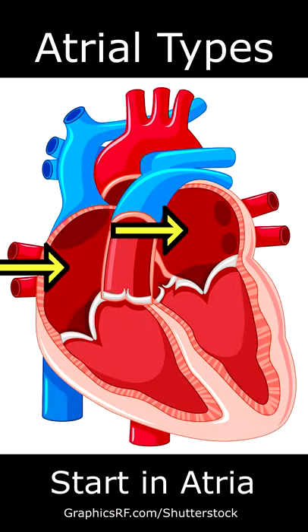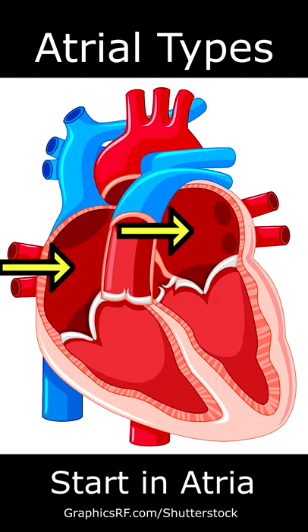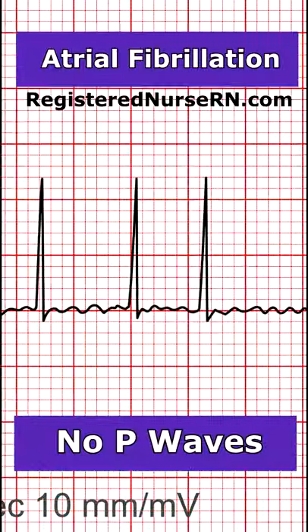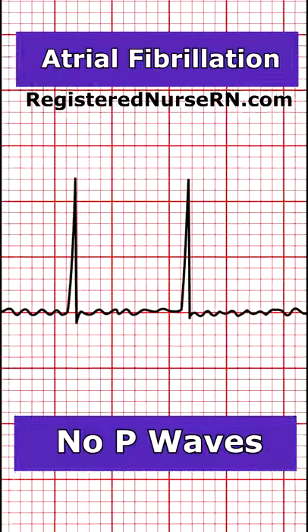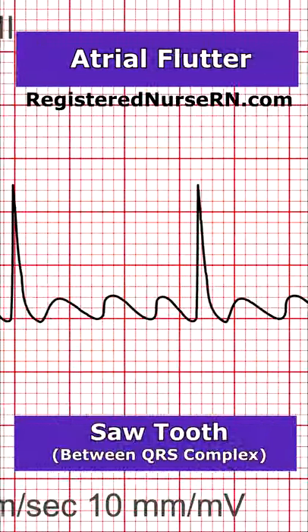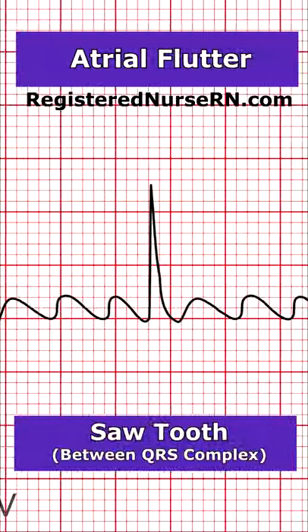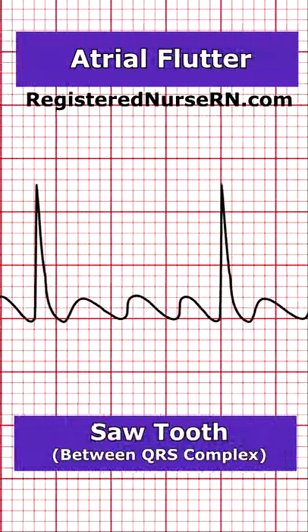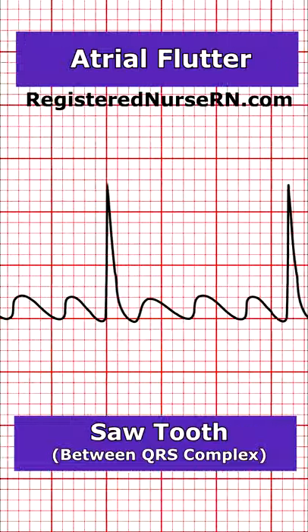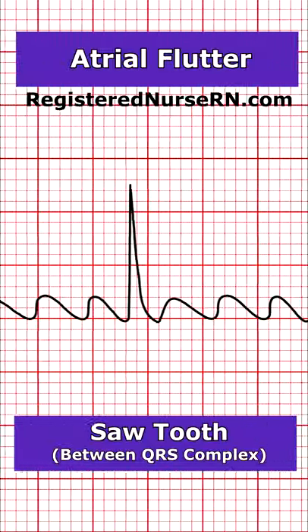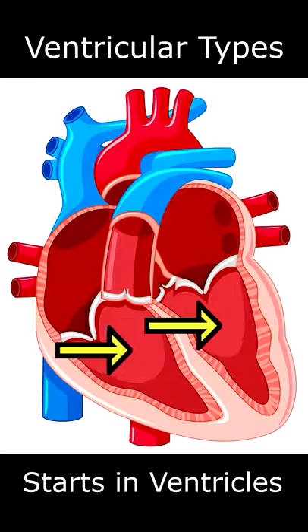Then we have the atrial types, and their electrical signals begin in the top chamber of the heart, the atria. We have atrial fibrillation, and here notice there's no P waves. Then we can have atrial flutter, and notice that sawtooth appearance between the QRS complexes — that's what gives it a different appearance than atrial fibrillation.